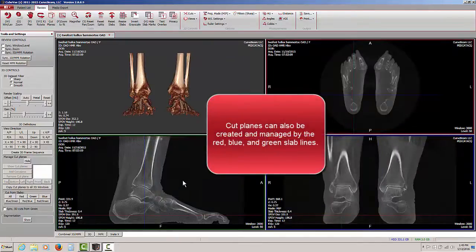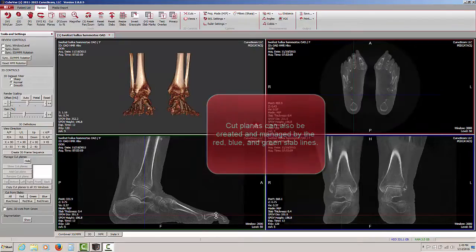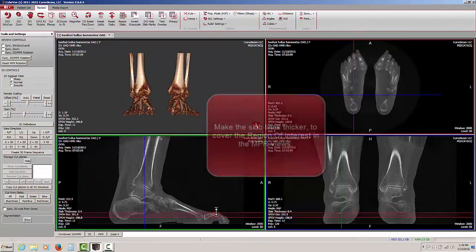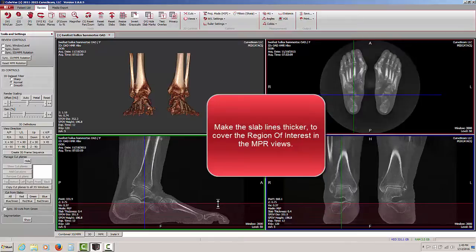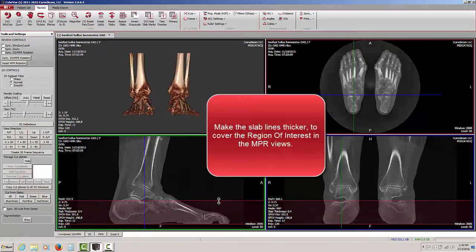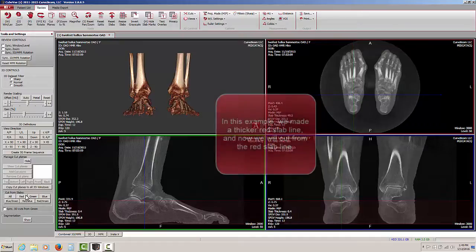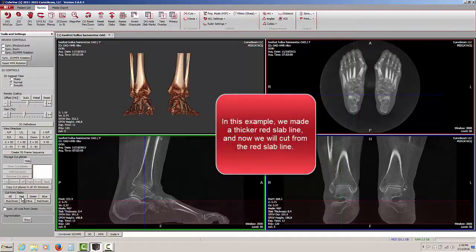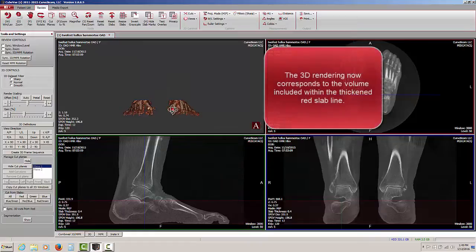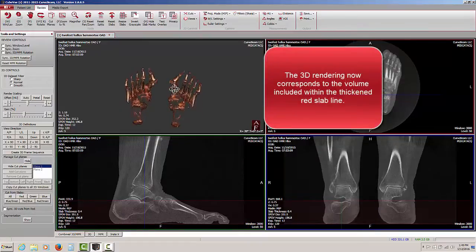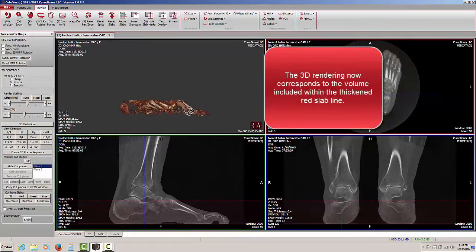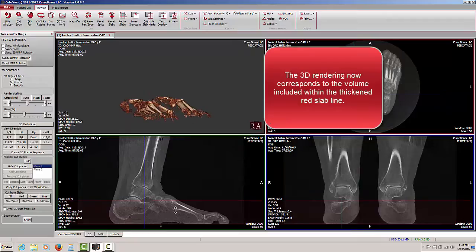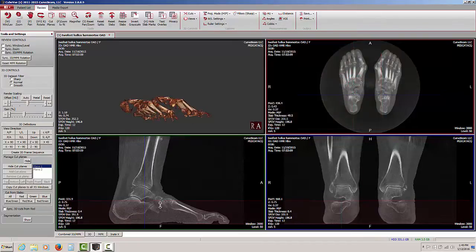We can also control the cut planes by the slab lines, the blue, red, and green lines. I am going to make this red slab line thicker, as you see here, and then I am going to cut from the red slab in this second set of controls under manage cut planes. In doing so, I now get a 3D rendering that is the same thickness and width of the red slab lines.